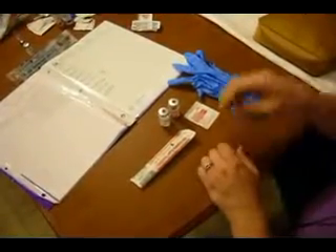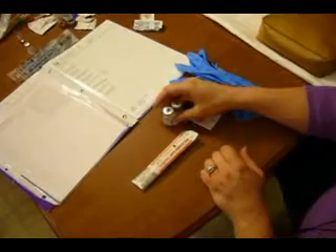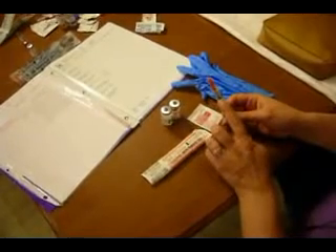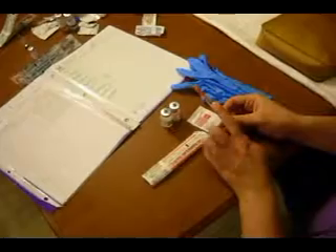Subcutaneous injections. One of the medications that we can give subcutaneously is insulin, and you saw that being drawn up in one of the other videos. So now once we have the medication all drawn up out of the vial of insulin, the last thing we're going to do is double check our dose one last time before we transition to giving it to our patient.